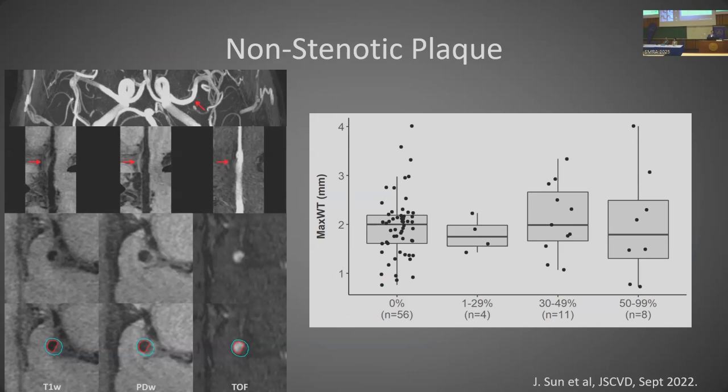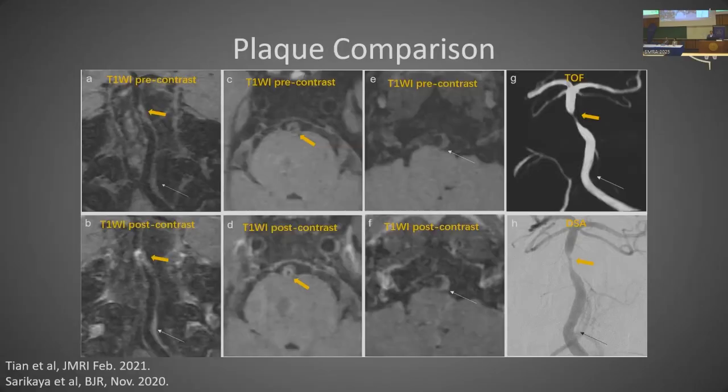That's really predicated on the fact that, as was mentioned in a few other talks, plaque a lot of times outwardly remodels. In that setting, MRA and CTA don't really do a good job of evaluating plaque burden and can't really establish stroke risk or stroke risk stratification in the setting of atherosclerosis.